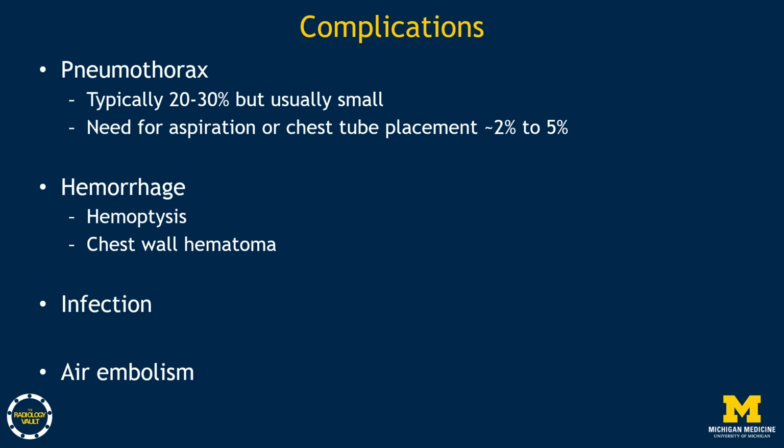Of course, the best treatment for any complication is prevention and risk mitigation by selecting nodules and needle trajectories without high-risk features and by incorporating meticulous technique and awareness during the procedure.